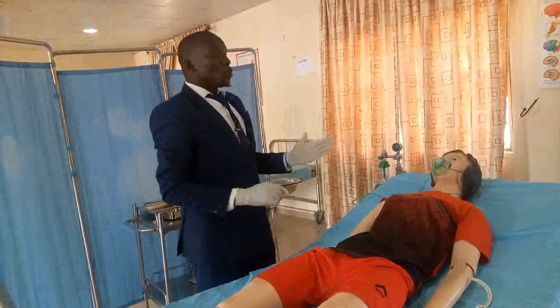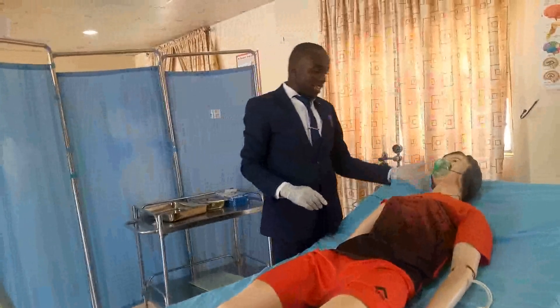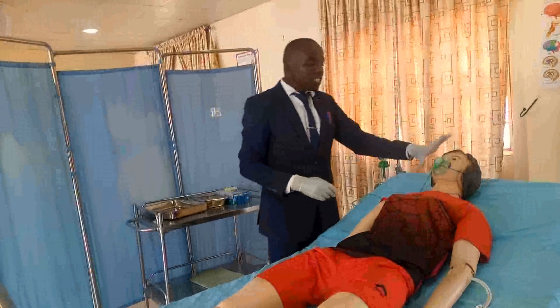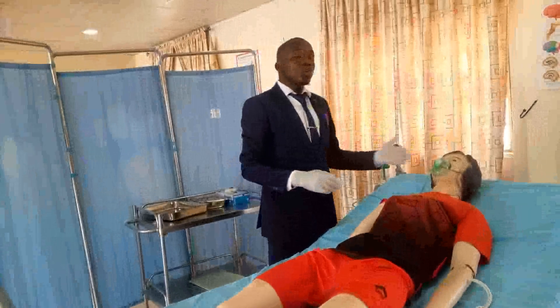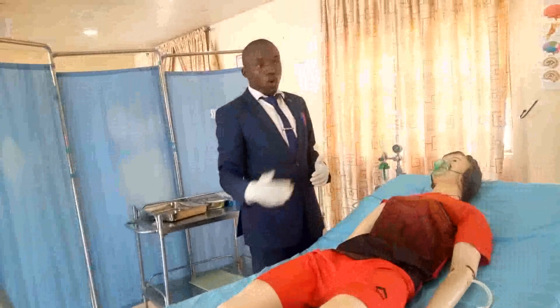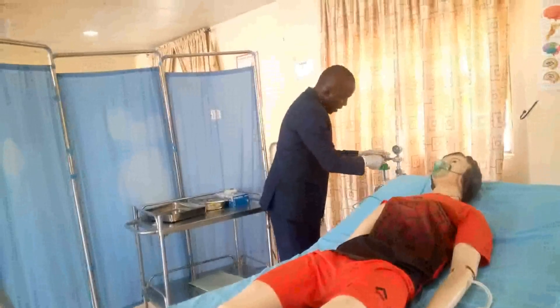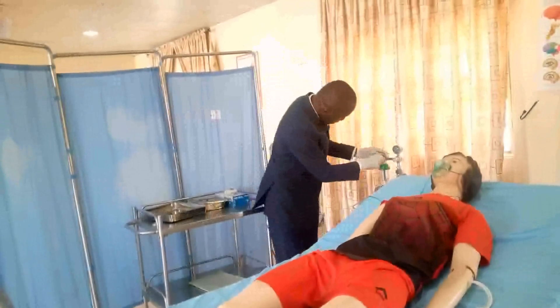Assess the patient's nostrils for signs of skin irritation every four hours, and wash the patient's face and mask every four hours. Monitor the patient continuously throughout the oxygen administration. Then open the oxygen and regulate it to the prescribed liter flow.